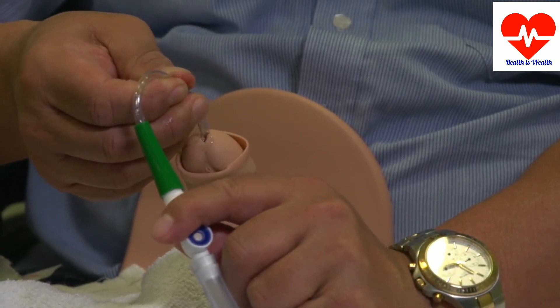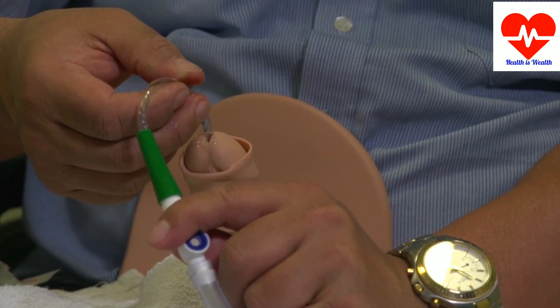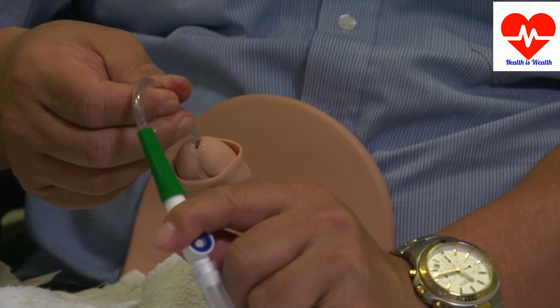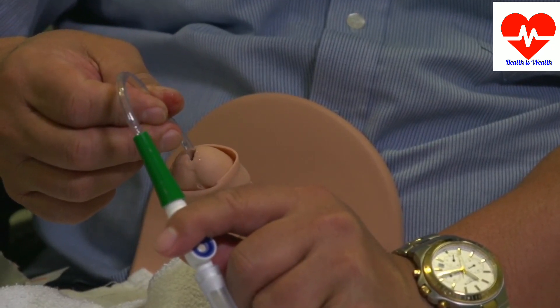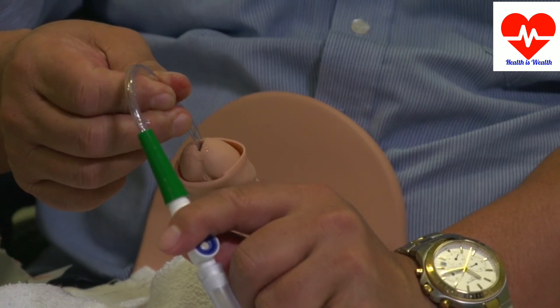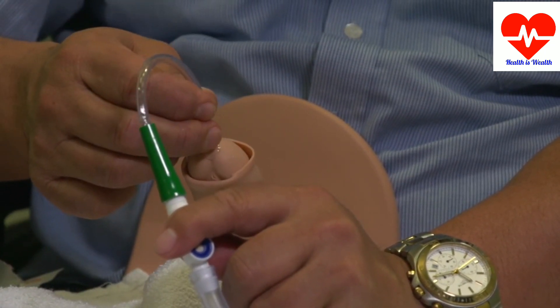Once the stream of urine stops, withdraw the catheter about one centimeter at a time and watch the stream start up again. When it stops, pull it out another centimeter. Watch your urine flow again. Repeat this step until the bladder is completely empty.